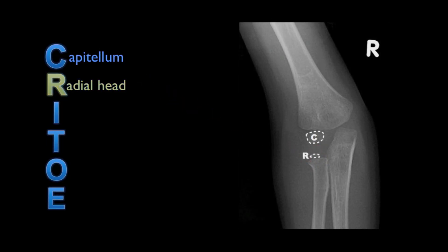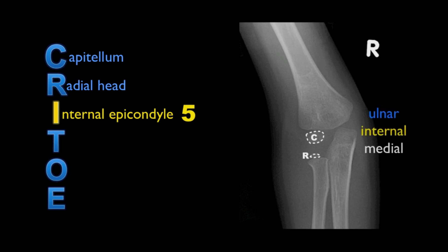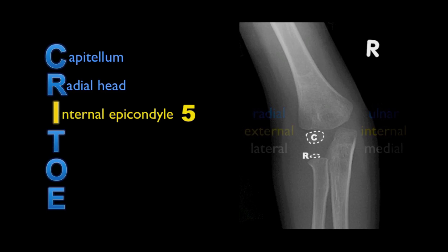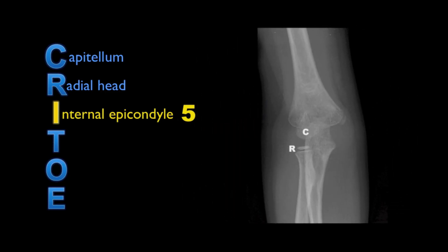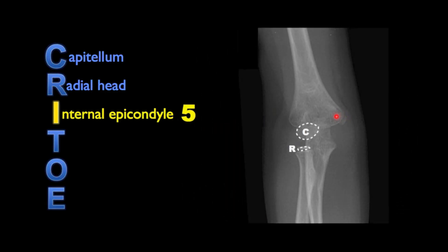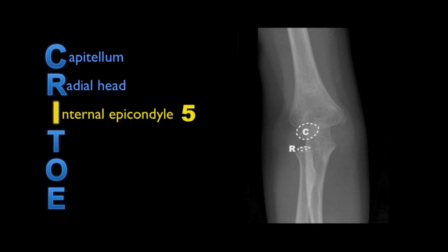The third ossification centre to appear is I, the internal epicondyle, appearing at around age 5. At this point it's worth remembering that the ulnar aspect of the elbow is the internal or medial side, while the radial aspect is the external or lateral side. This child has not yet developed their internal epicondyle ossification centre, so if we switch to a slightly older child we can see it here overlapping the distal humerus, which is typical of the internal epicondyle.